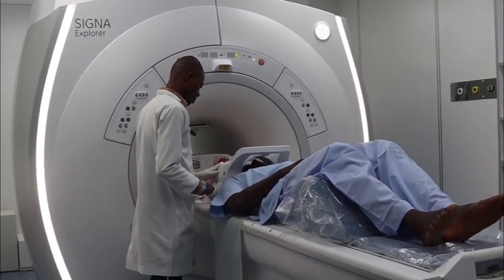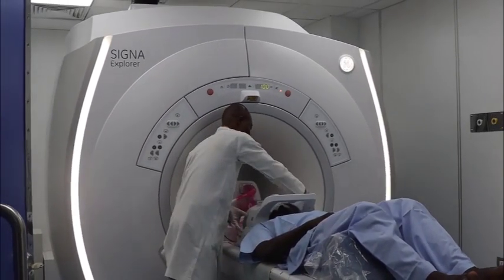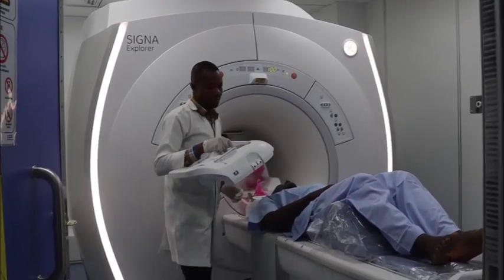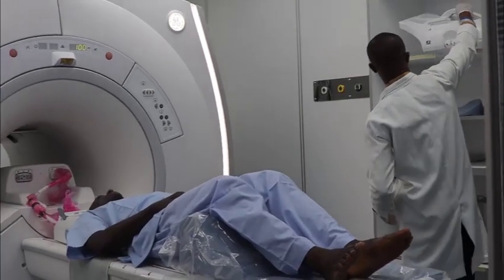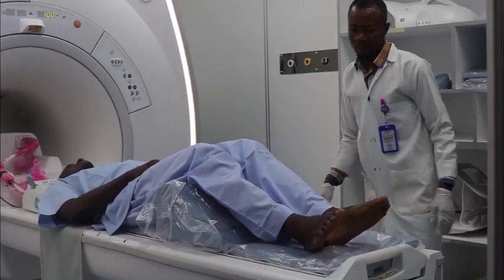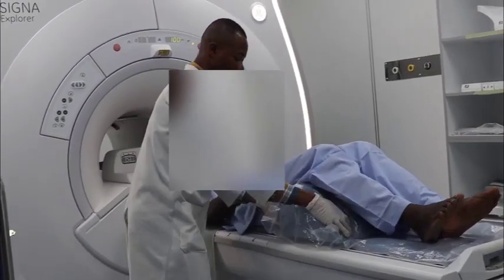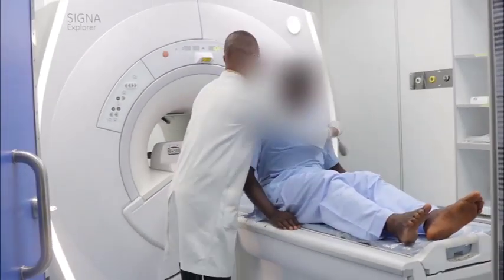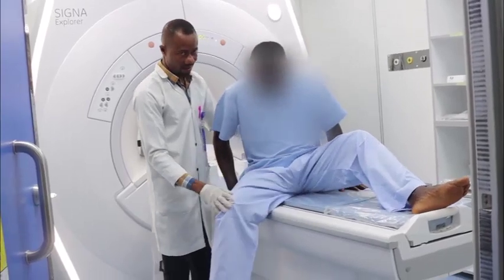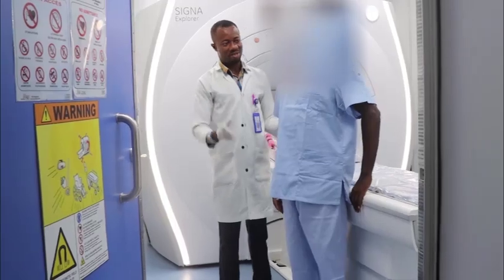Sometimes some persons are scared about seeing a machine like this. Sometimes they've heard of X-ray and they are very scared. If X-ray is like that and is very dangerous, what about this one? Is there any contraindication? Is there any side effect? Actually, for MRI, there's no proven side effect at all, because it's not making use of ionizing radiation. It only makes use of the magnetic field interacting with the hydrogen atoms, the protons, which it picks signal from and reconstructs into the images we see. So it doesn't have any side effects.